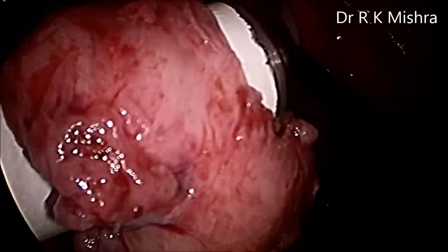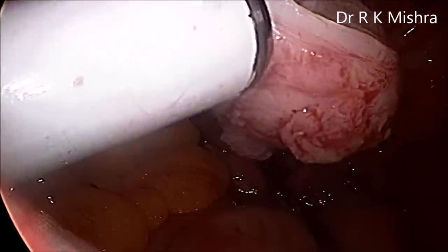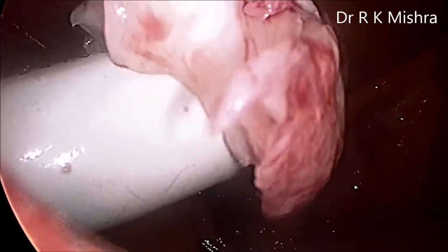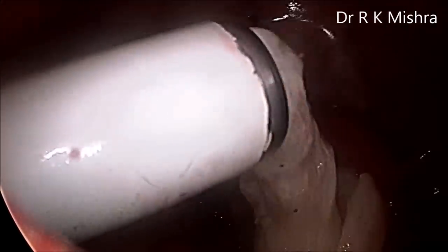Ports must be closed because they are now 12 mm, to prevent post-operative hernia. After morcellation of all the tissue, port closure was performed. This was a straightforward case of ovarian cystectomy and myomectomy. Thank you very much for watching this video.